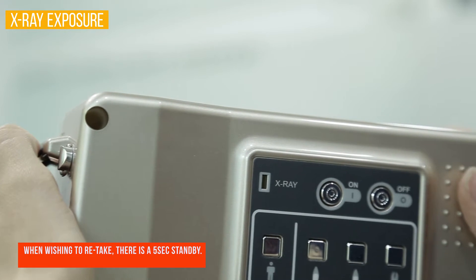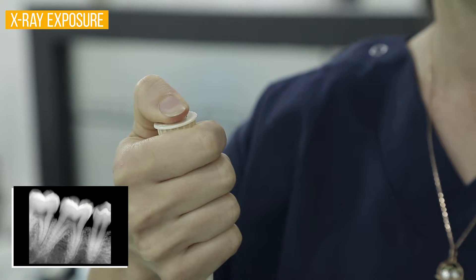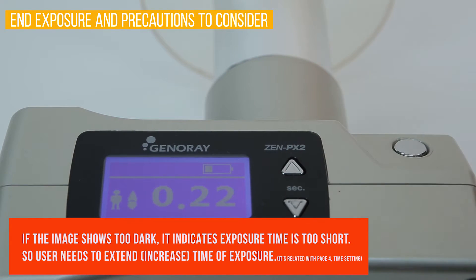Press the exposure button fully so the equipment produces enough X-ray as set. When exposure is complete, there will be a buzz sound and the yellow LED will turn off. After exposure, check results. When the result is blurry or dark, adjust the time setting and take an exposure again.